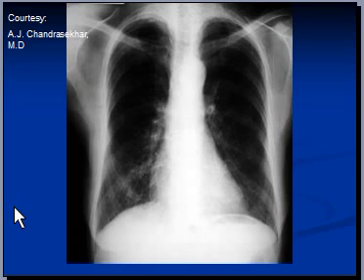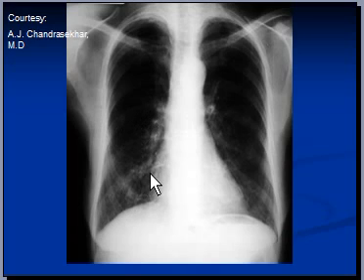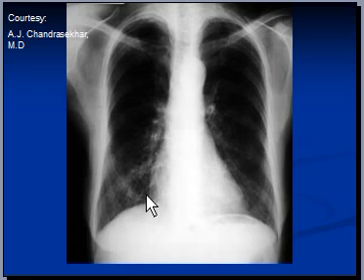Right middle lobe collapse can often be missed on a frontal radiograph, as in this case. But if you do see a collapsed right middle lobe on a frontal film, you will notice that the horizontal fissure has moved inferiorly and medially as a result of collapse. Often the right heart border will not remain visible — a positive silhouette sign — and often the medial border of the right hemidiaphragm is raised as a result of collapse.